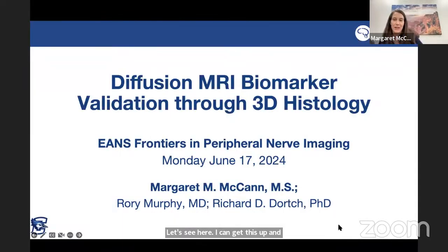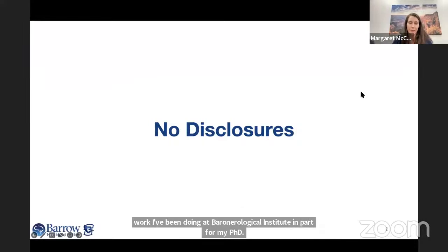Okay, so as mentioned, I am Maggie McCann, and today I'm speaking about diffusion MRI biomarker validation through 3D histology. This is work I've been doing at Barrow Neurological Institute in part for my PhD. So, I have no disclosures.